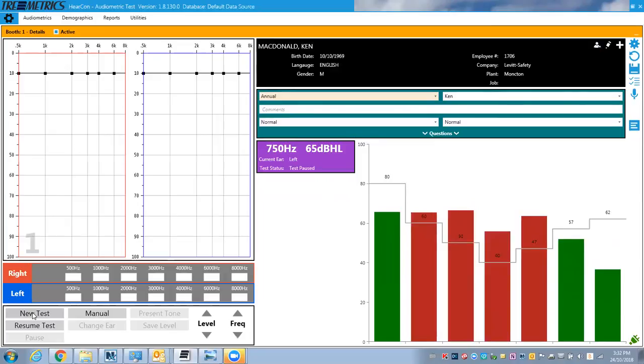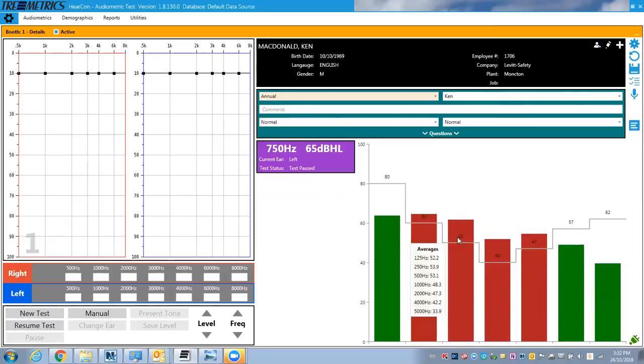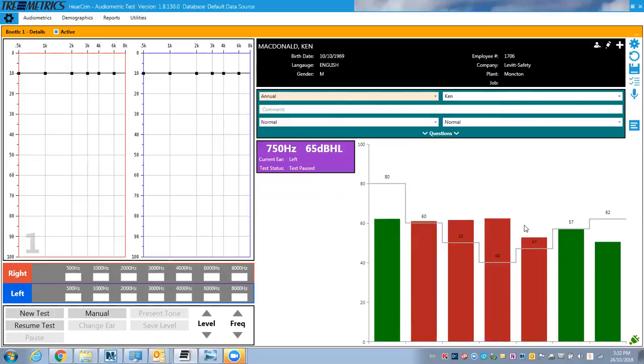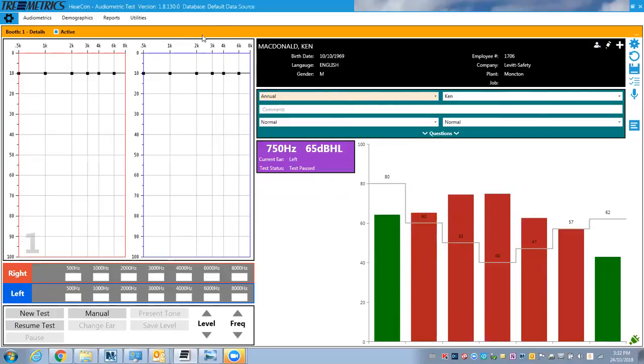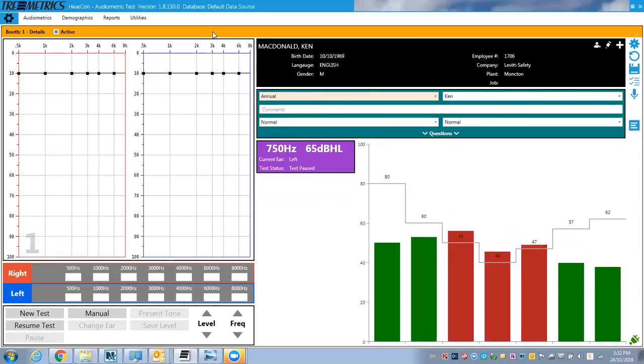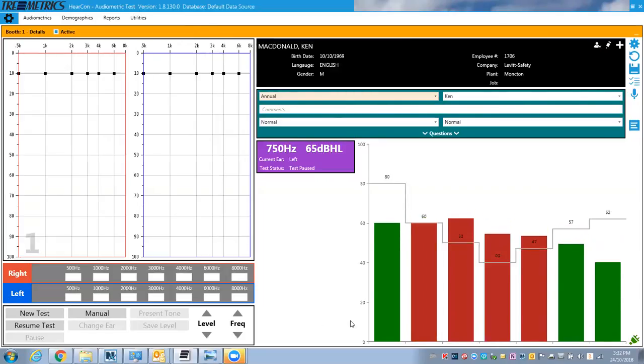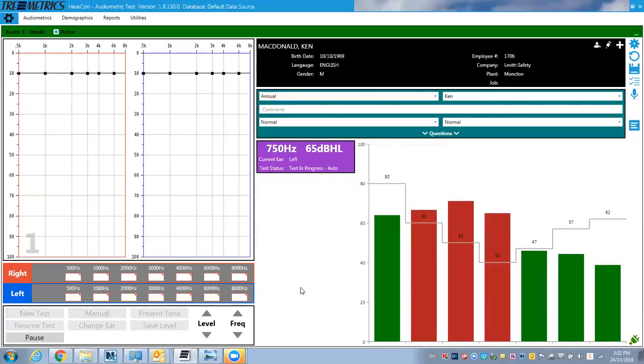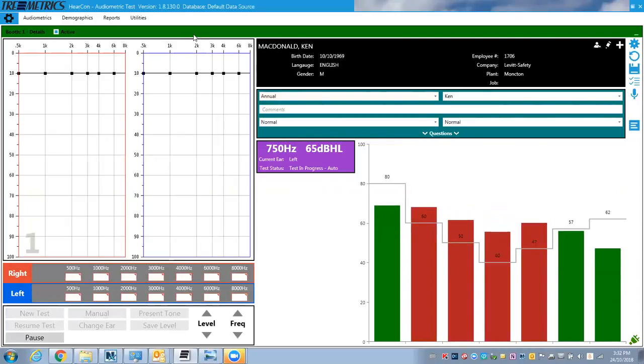If I hit new test, I have this feature turned off because every time I'm talking, I'm putting it over the limits and would constantly be pausing the test. It's paused now anyway, just because I haven't started it. But this will turn from orange, it'll basically go away once I start the test.